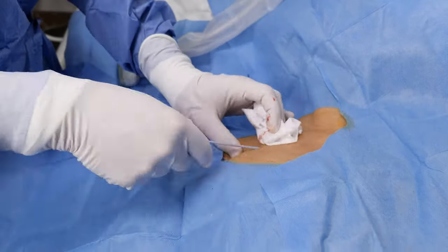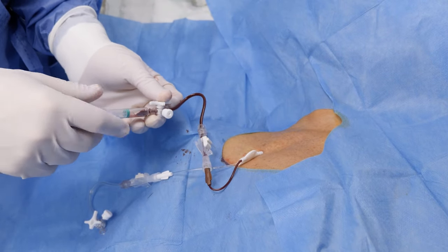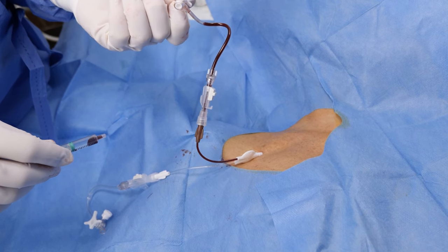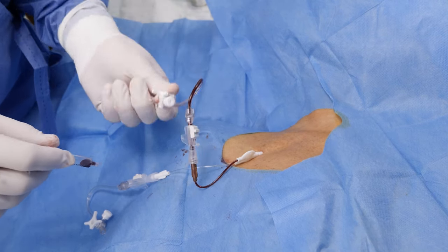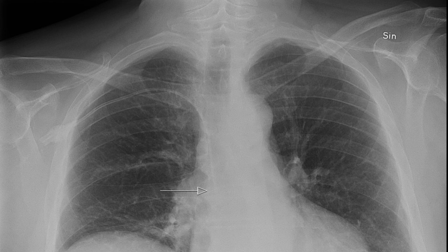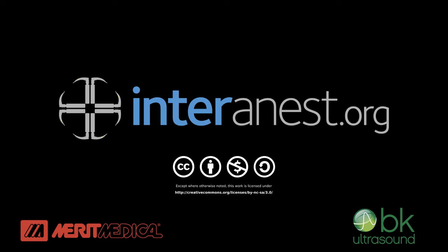Proceed with the central line in the usual manner, then further confirm venous placement by observing the height of a non-pulsatile blood column. We're currently performing a validation study, but we believe that most post-procedural x-rays will be redundant if the guide wire position has been confirmed using this technique. For more videos on anesthesia and critical care, go to interanest.org.